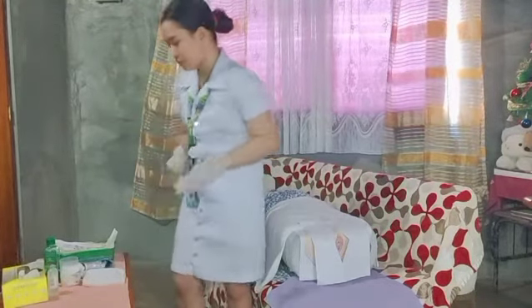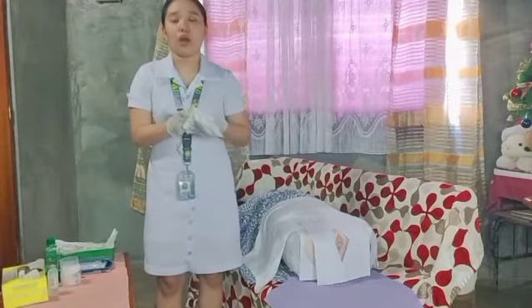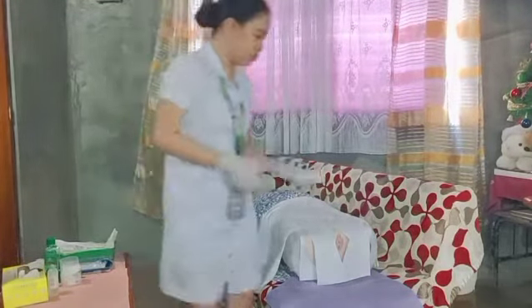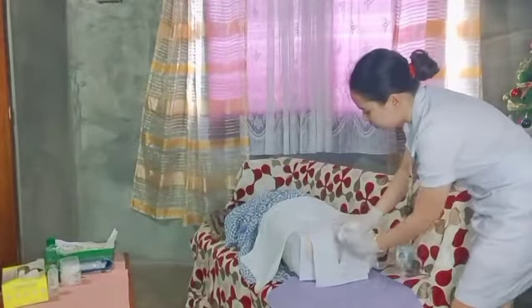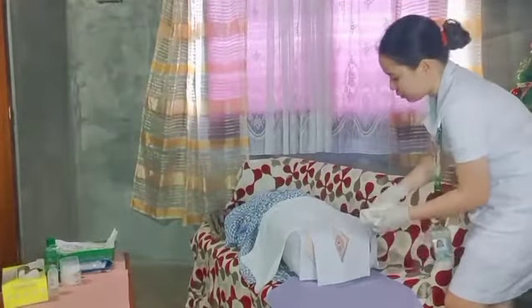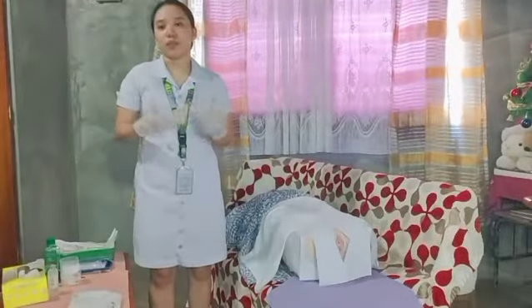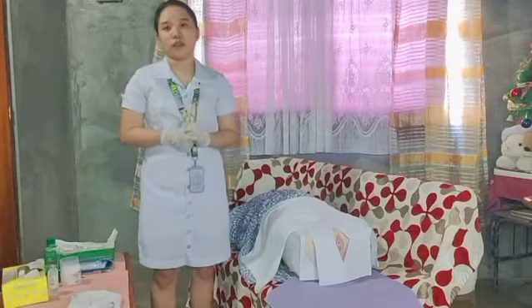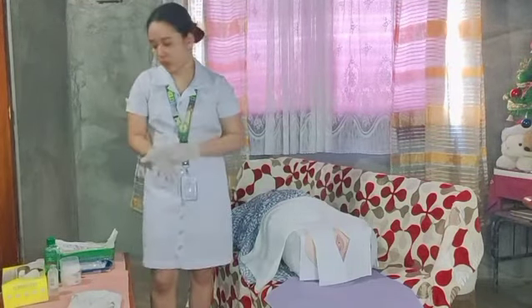So we're going to use the washcloth, and clean with cotton balls following the proper stroke, top to bottom, inner to outer stroke.